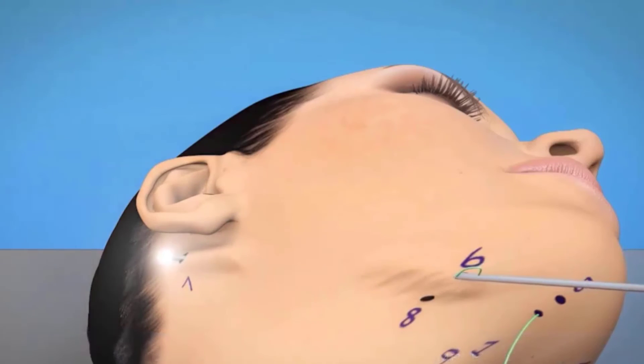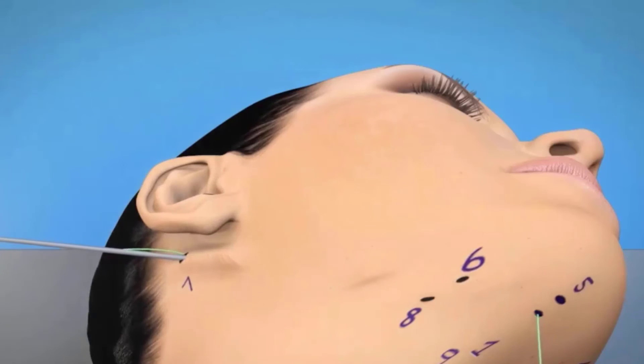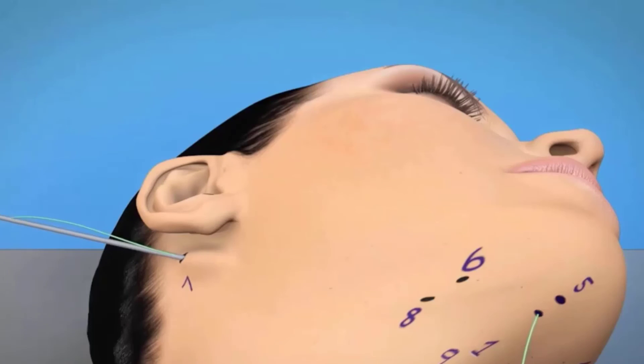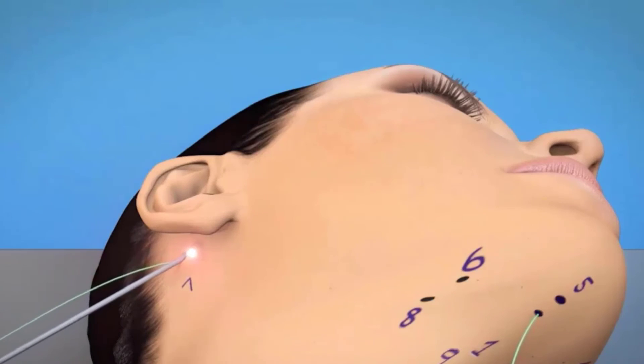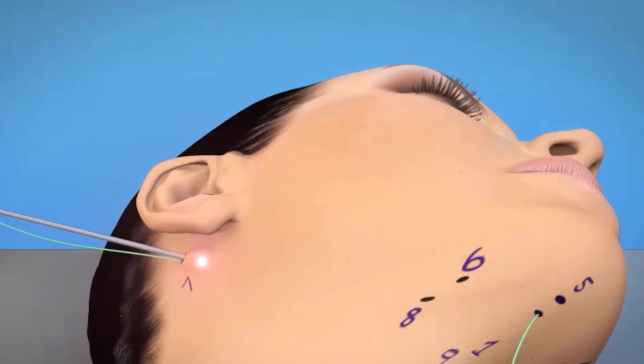Mirroring anchor point 3, the rod is brought out through point number 7. Point number 7, just like point number 3, is an anchor point behind the ear just overlying the mastoid fascia, which has a very dense anatomy of ligamentous attachments. This allows firm anchoring of the suture system.